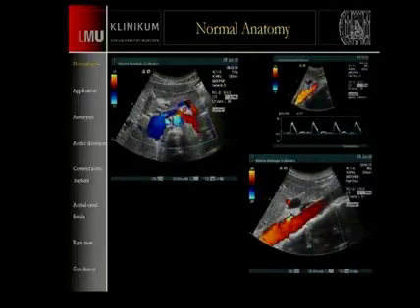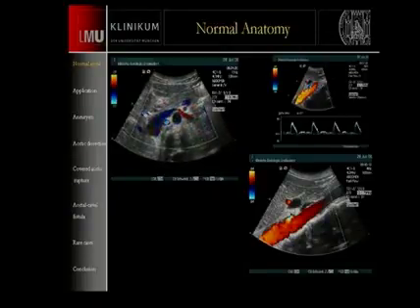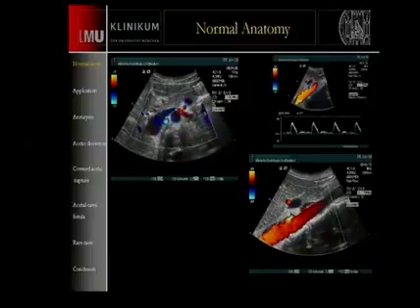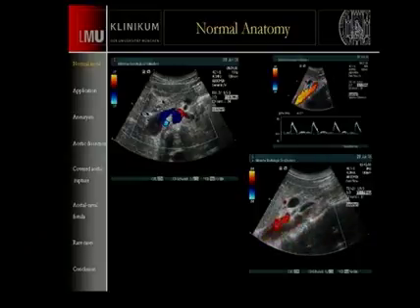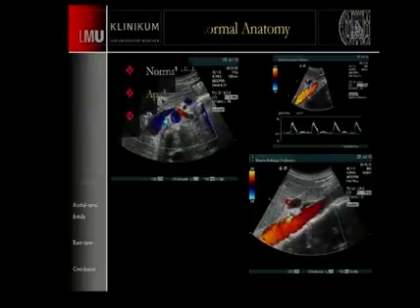Also, we use the next step. The next step will be color Doppler information. We see a nice filling of the aorta. We see also the IVC here. We see a normal curve from the aorta. And also in the longitudinal view of the aorta, we see no turbulence. So major information already exists in this image. There is no need to use contrast.